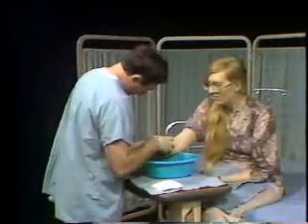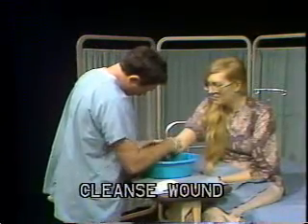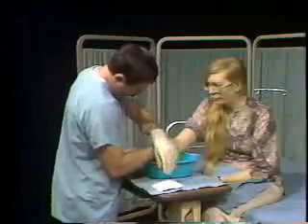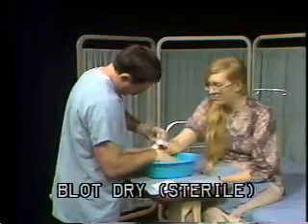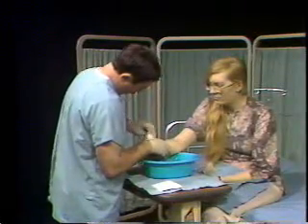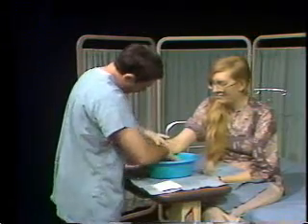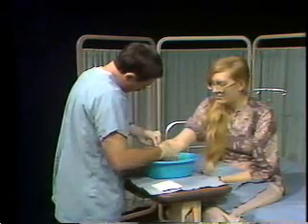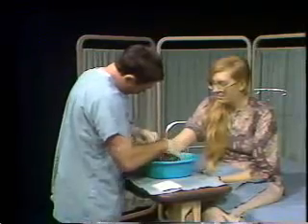According to the physician's orders, have the patient soak the wound in an antiseptic solution for 10 minutes. A suitable solution is betadine and water. Dry off the wound with sterile 4x4s and re-inspect it for cleanliness. If it still contains debris, scrub and irrigate the wound. It is imperative to remove all debris from the wound in order to prevent infection and an overgrowth of scar tissue.